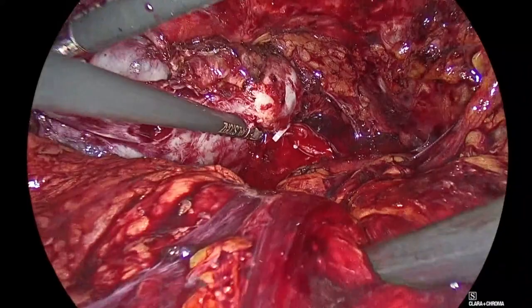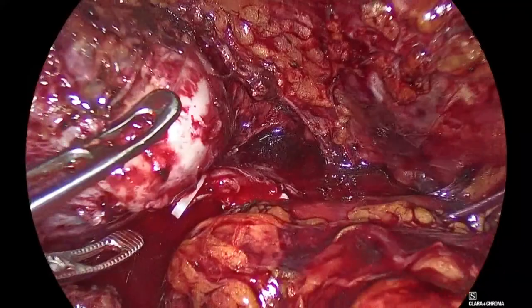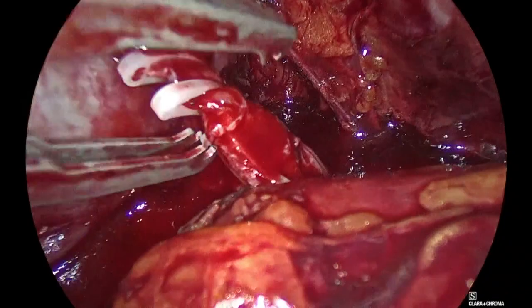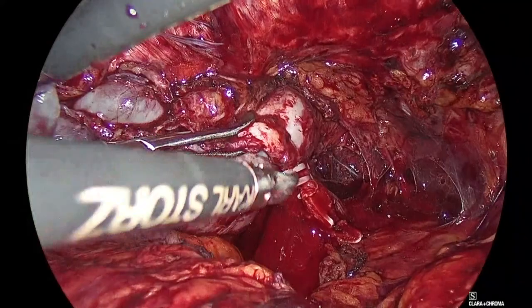The problem with the other clip is that it will go, give me a strong grasper, it will go quite vertical here, but let's see. So let's pull the prostate out like this. This is where the vessel is. Isn't it possible to come from the right side with your clip? I know I have. Look, here it stops. Eh? Good. Good. I have my 12-millimeter trocar on my left hand. Scissors? You could if you put a 12. The assistant has two fives. Yes, two fives.